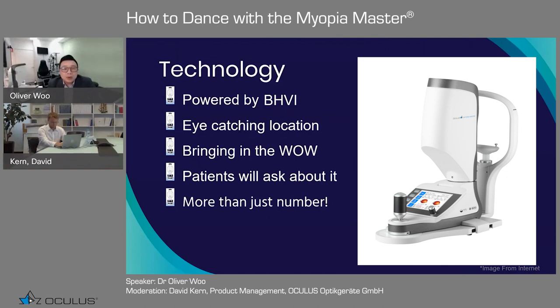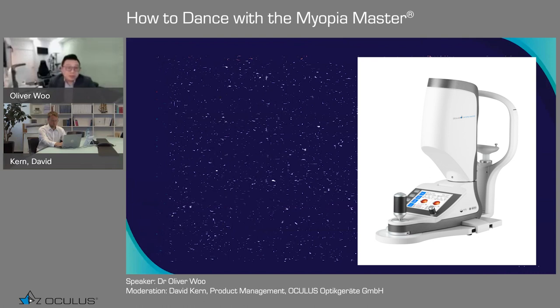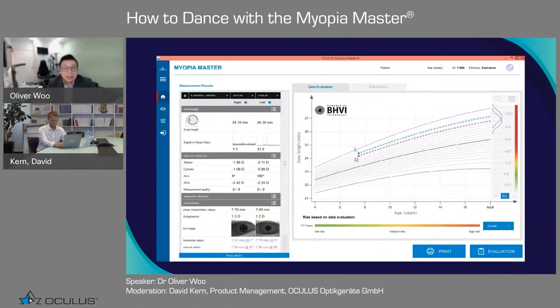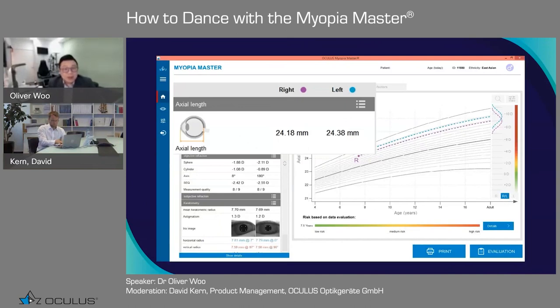Because I tell them this machine is more than just a number. The machine is not just telling what the number is. The machine is also a risk teller. It's telling us if we don't manage the myopia properly, what the risk is that your kid is going to face in the future. So this is one of the kids we had at the beginning, the axial length is 24.18, and he was about 7 years of age.